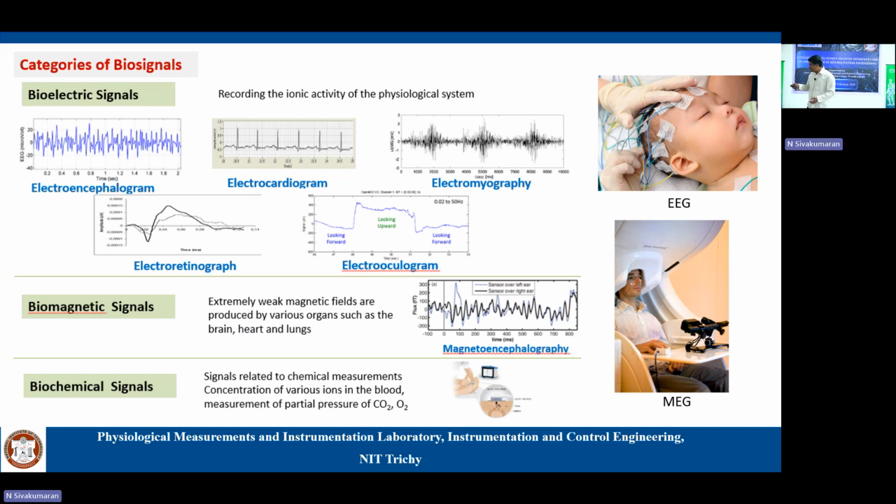So in that case, we can go for either EEG or EOG. EOG is another very nice choice, but the drawback is we have to place sensors above our eyebrow, and on both sides of the eyes, left and right. So EOG would help those we call tetraplegics or quadriplegics.